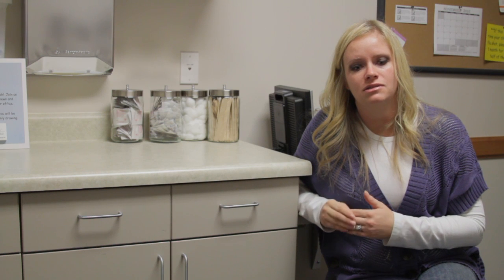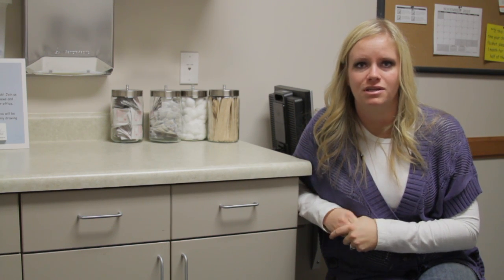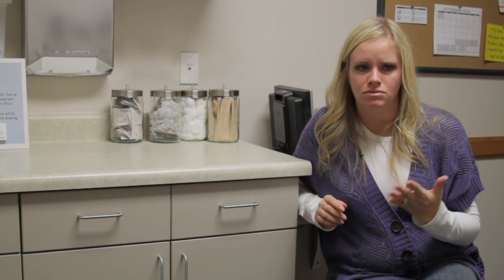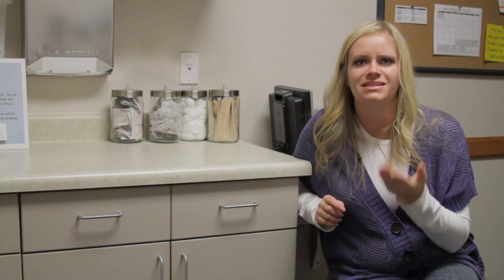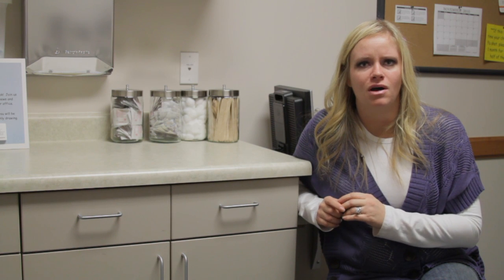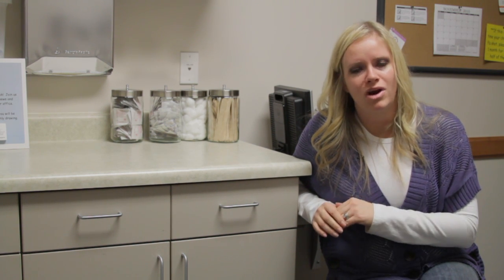How these IUDs work: the Mirena IUD works by having a progesterone hormone that's slowly excreted that prevents ovulation. The Paragard IUD works by changing the pH inside of the uterus so the sperm don't survive if they make it up there. And they both have a little string that comes through the cervical opening. That's how we get the device up in there and how we remove the device as well.